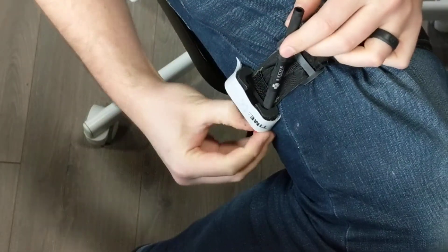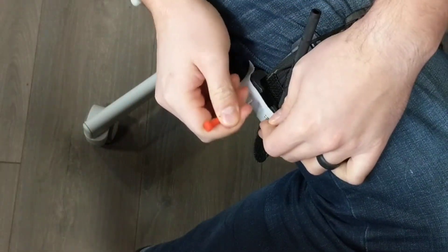You can put your time bar across, grab the pen out and record the time of application.